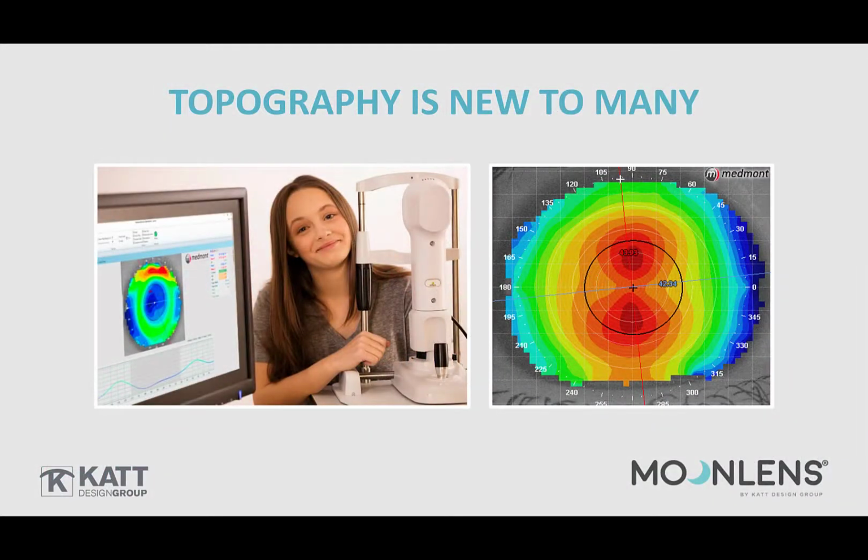For many neophyte orthokeratologists, corneal topography may be a new instrument to the practice. And for those familiar with topography, but just starting ortho-K, there may be analysis options or functions that are unfamiliar. This training tool was designed to address the specific topography considerations that users should be comfortable with.